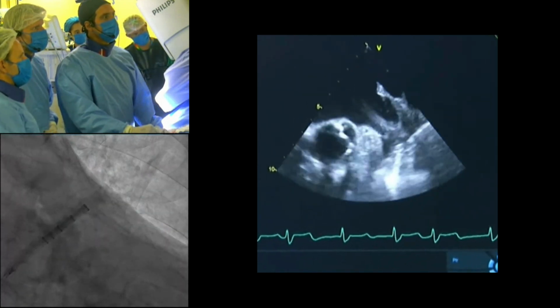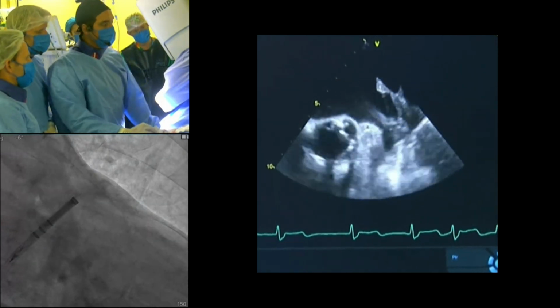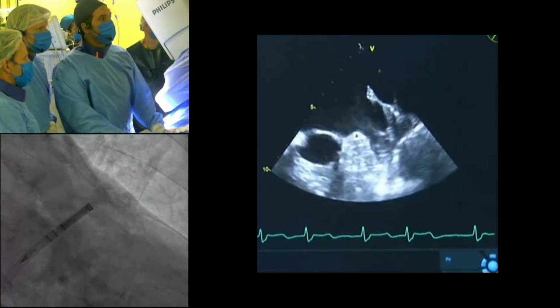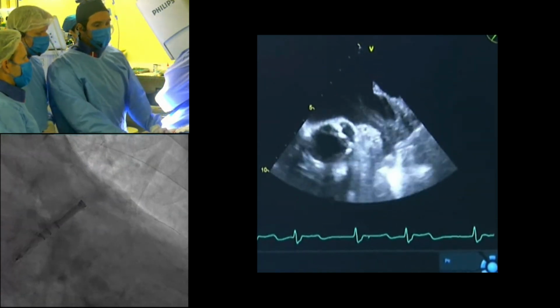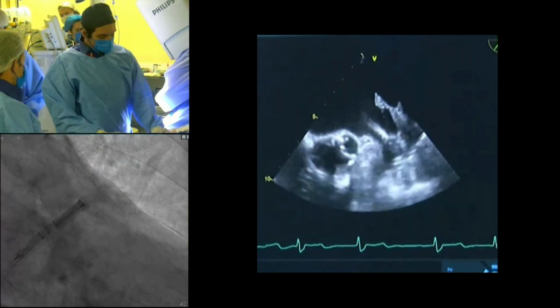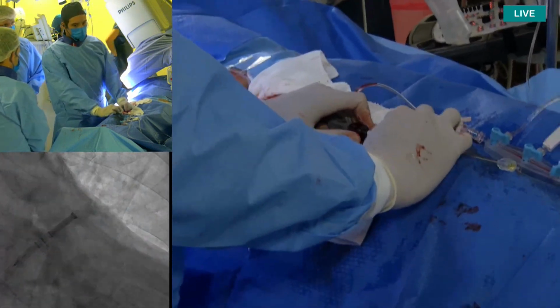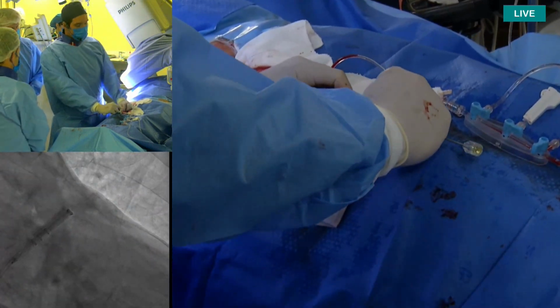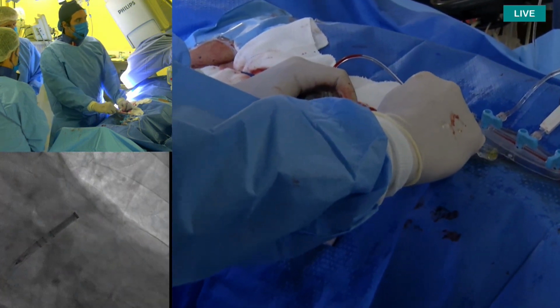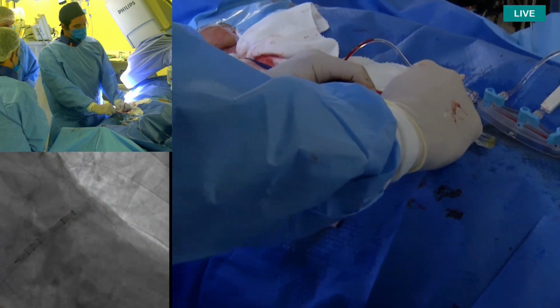Okay, so when I get to here, it's the time we're going to make the connection between the sheath and the knob. At this point, can somebody show our hands here? You can really film Felipe's hands. So Felipe, you are holding the device. Yeah, right now I have my right hand here, just holding the knob, and I'm going to bring back the sheath. So we have the connection here.